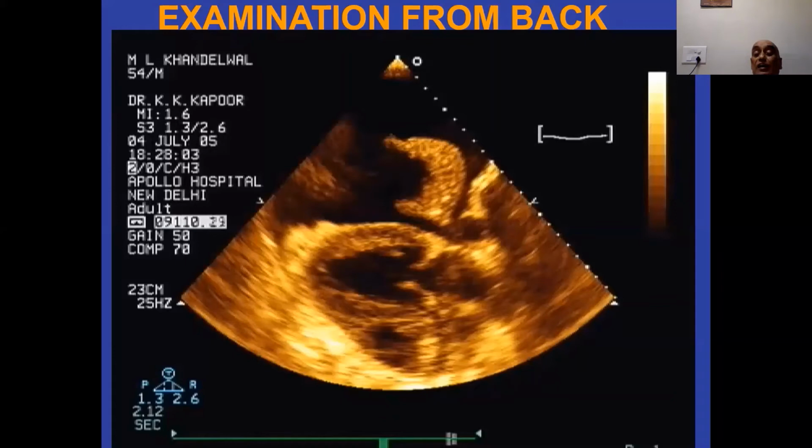You get the posterior wall of the left ventricular cavity, the interventricular septum, the right ventricle, and the pleural fluid, and you can get the image of the lung. Otherwise, the lung is not imaged. Here you get the image because this is a collapsed lung. There's atelectasis of the lung because of the pleural effusion, and you get a consolidated lung which is highly echogenic. So it's a very good view to diagnose pleural effusions.